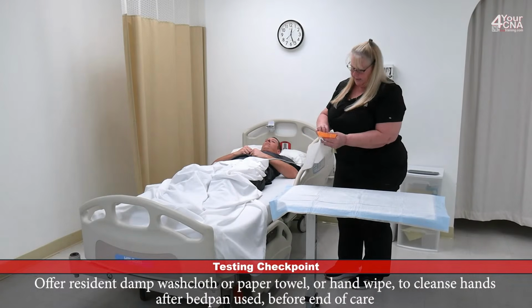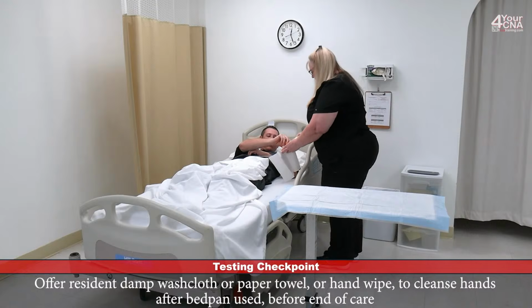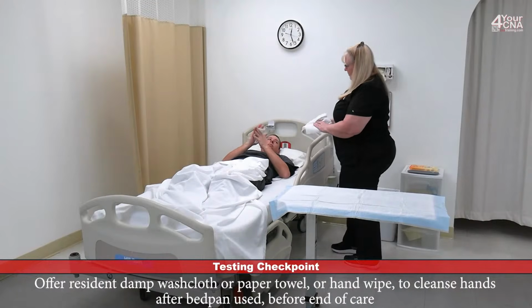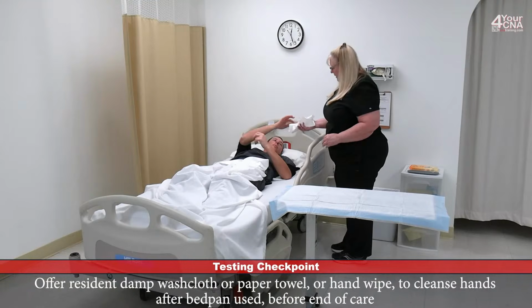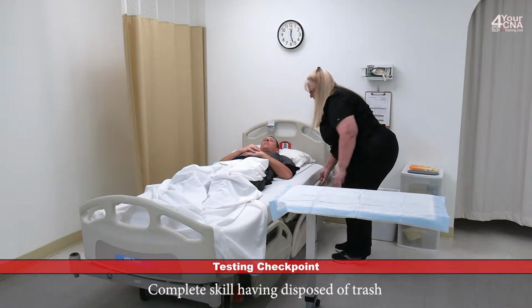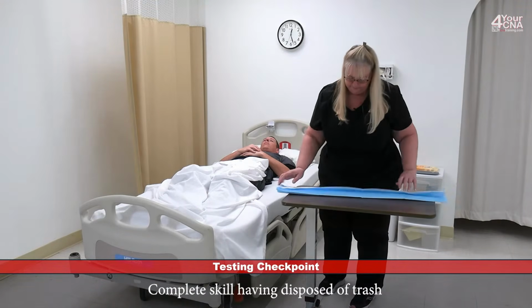Mr. Jones, I'm going to give you a hand wipe so you can wash your hands after using the bedpan. Go ahead and take a hand wipe. And then I'll collect that hand wipe after you're done with the paper towel. Thank you. This keeps me from touching the hand wipe. We'll throw this away. We're going to throw the barrier away.